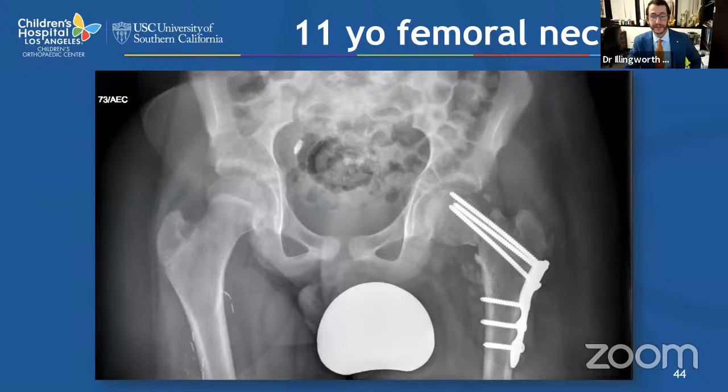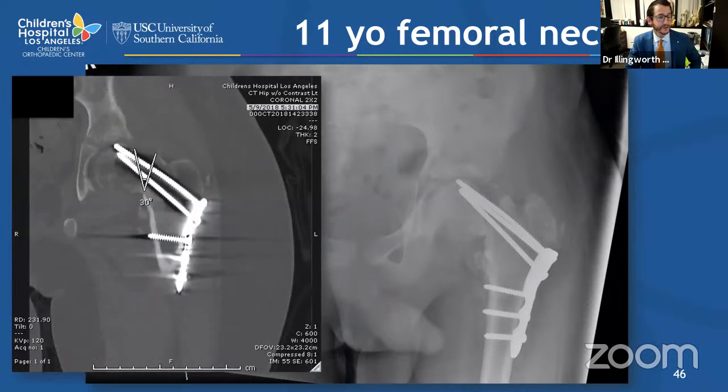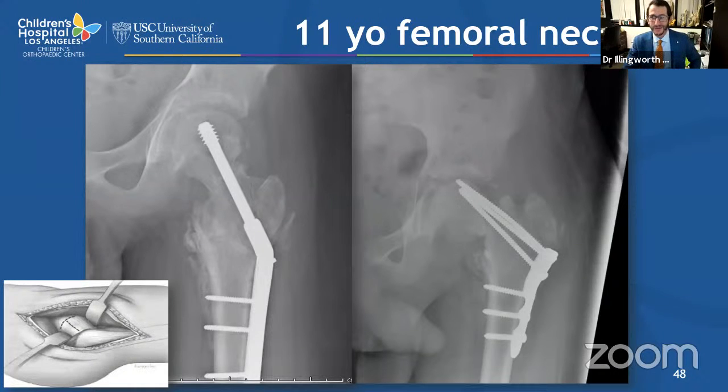And as we can expect, this is where he is 4 weeks after his initial fixation and fall, with continuing varus collapse and screw cutout, where he's got screw penetration into the joint, which puts him at risk for chondrolysis. Certainly this needs some TLC in order to get him into a better position, even though he's at significantly high risk for future complications. So essentially what we did was a revision open reduction and internal fixation. He had previously had an anterior lateral Watson-Jones based incision, so we used that exact same one.